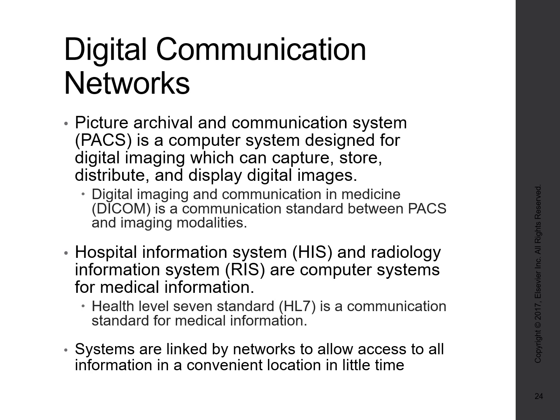Now, another system used is called Health Level 7 Standard, and this is a communication standard for medical information. And I'm sorry, I said that was a computer system, but again, it's a set of rules. So we have DICOM to really set the rules for all of the actual images, but the HL7 is basically the set of rules for how HIS and RIS can work.